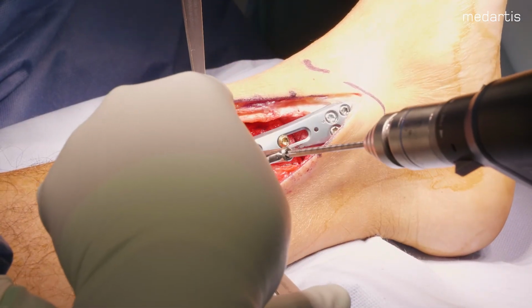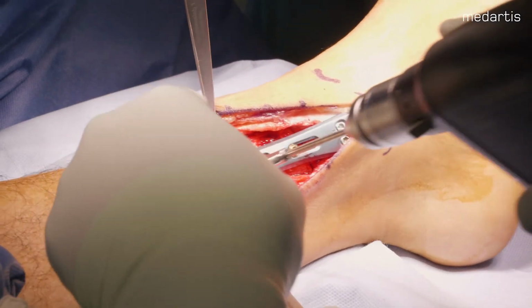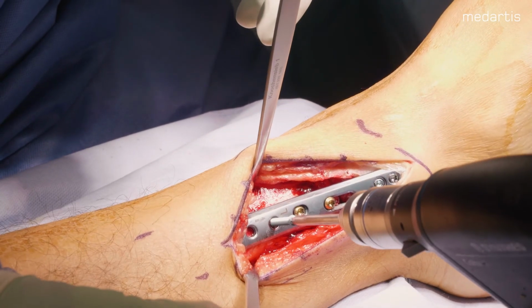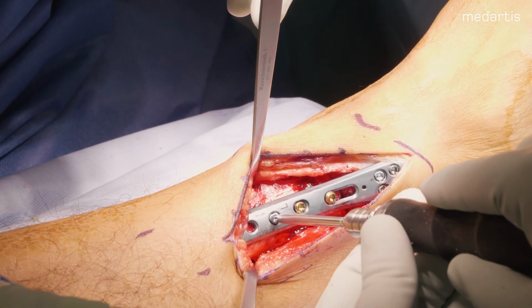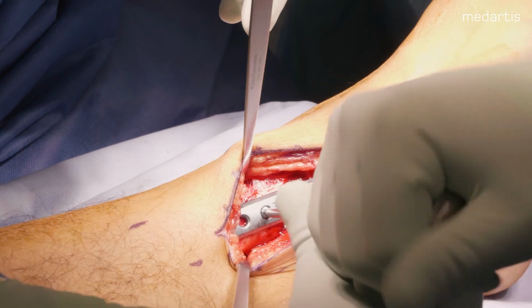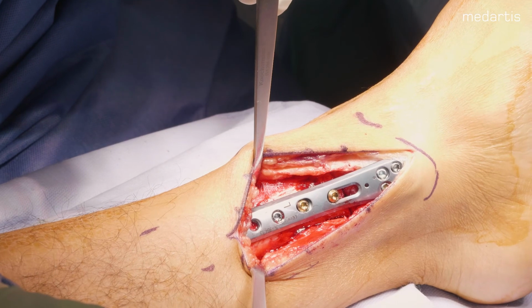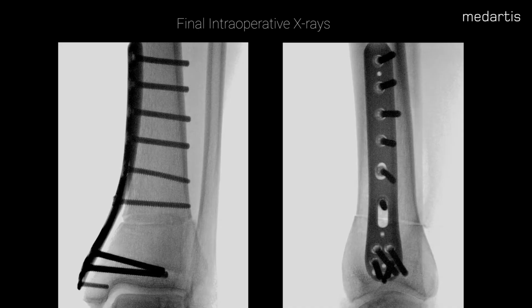A locking drill guide is used to fill the rest of the screw holes in the shaft with locking screws, which are inserted under power. And TriLock locking completed by hand. Here the final placement of the plate can be seen. Final X-rays confirm the plate and screw placement, demonstrating excellent compression and axis realignment achieved.